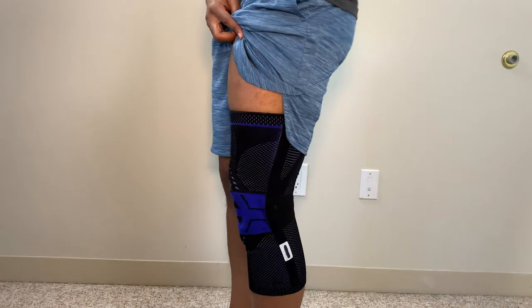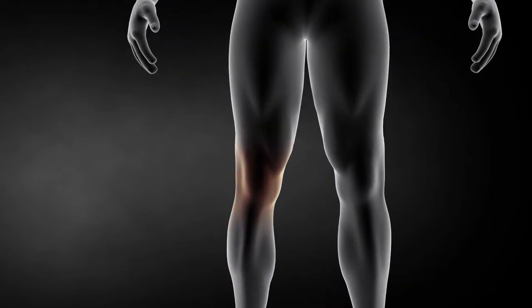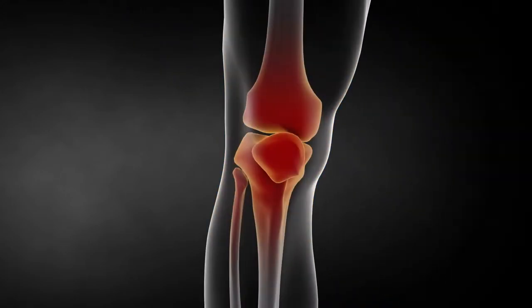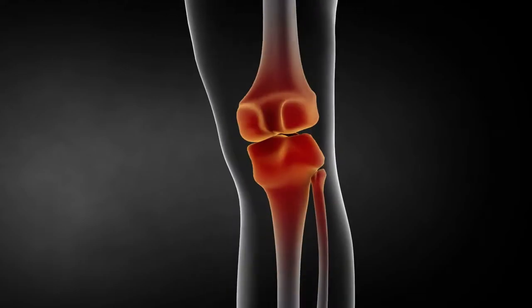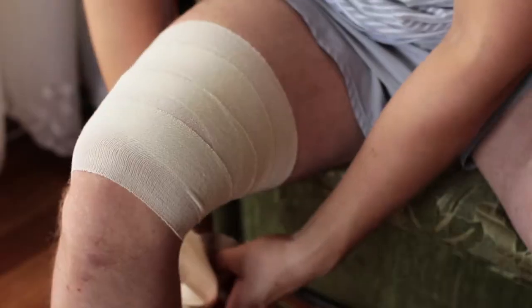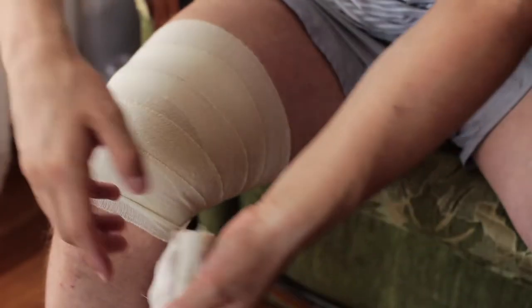The knee sleeve itself is really there to provide compression to your lower limb. In most circumstances, if you have inflammation or swelling, or if you have a kneecap that is moving excessively, a compressed knee sleeve is going to squeeze your limb and provide you the best outcomes. It will isolate your kneecap and the compression will help relieve some of that inflammation — it's almost equivalent to using an ace bandage wrap.